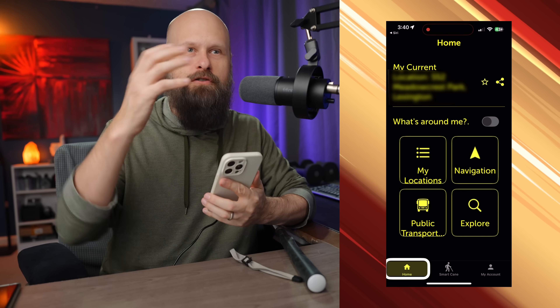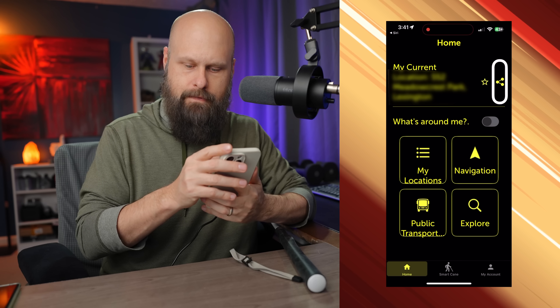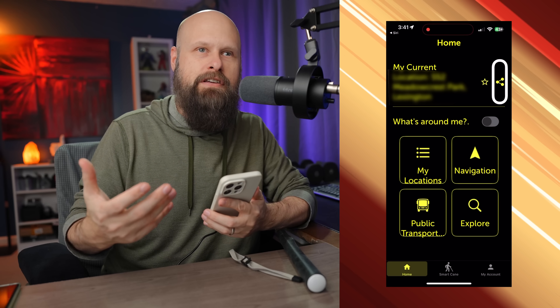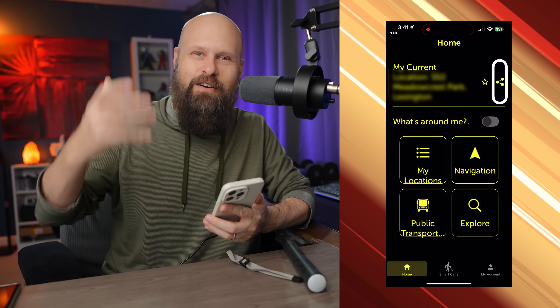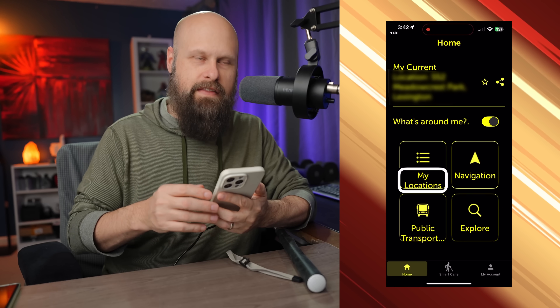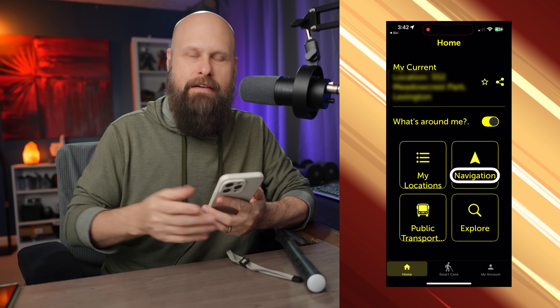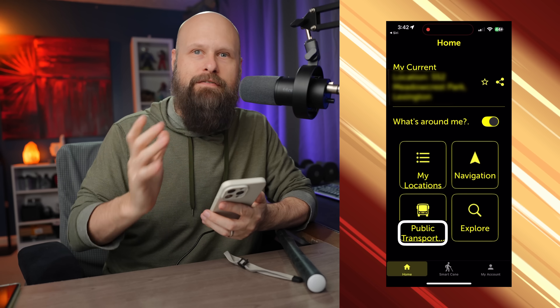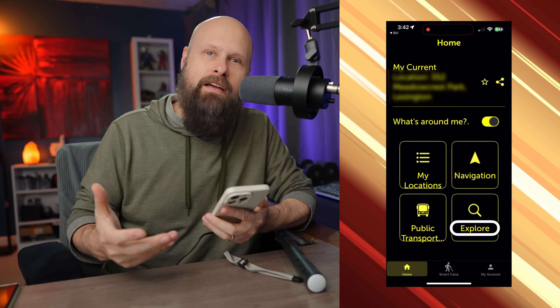At the very top of the app it shows your current location, along with a Save Location button and a Share My Location button. You can save a location to find it more easily in the future — for example, if you go to an amazing restaurant you want to visit again. Then there's My Locations, your list of saved spots. You also have Navigation for turn-by-turn directions, Public Transportation for lists of buses and trains if available in your area, and Explore to see what's around you.